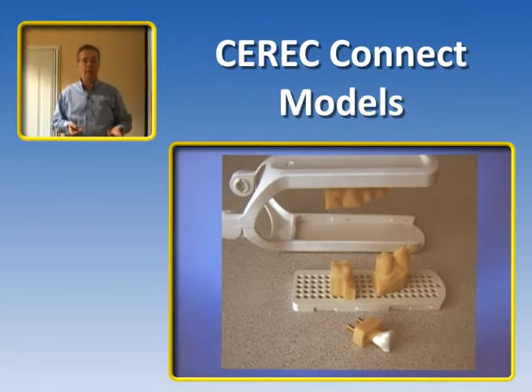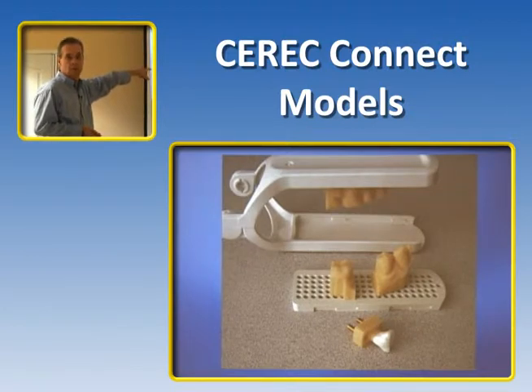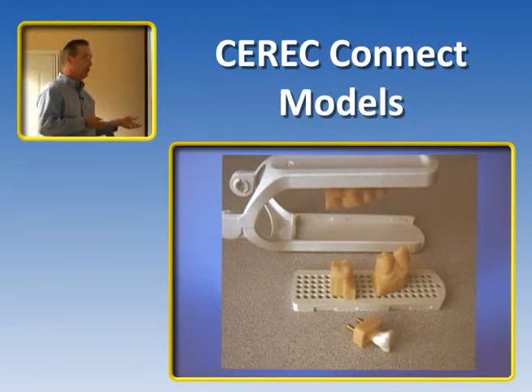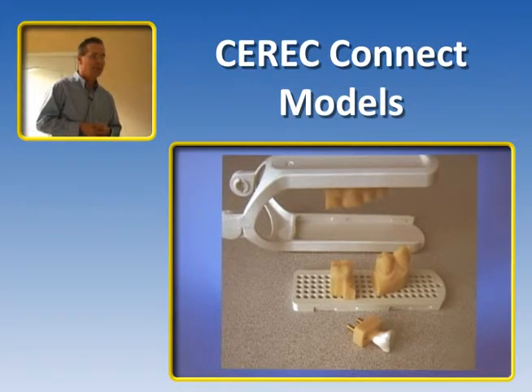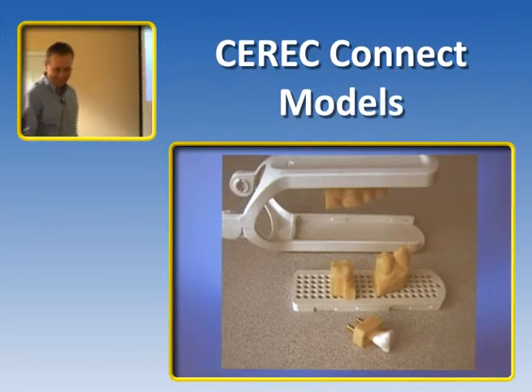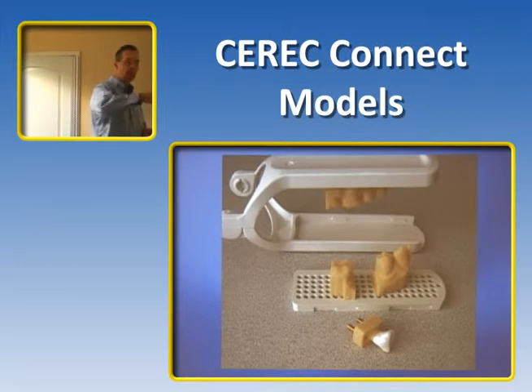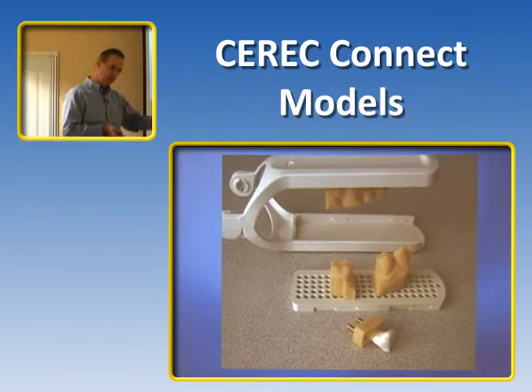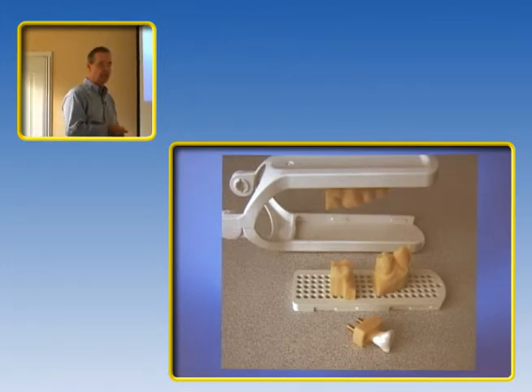Okay, so you'll be able to have that articulator in your office, and all the lab needs to send is just the platform. So you'll be able to end up interchanging those. And it works on this. How do I get one of those articulators? Ask. I'll send you one. Yeah. So that way then you have that, and anytime we send a case out, you can just have that platform and insert it.